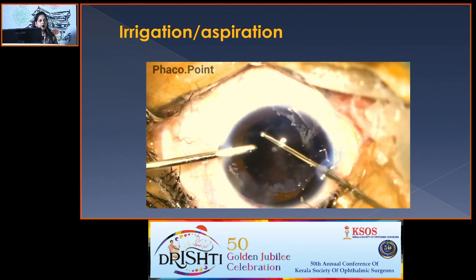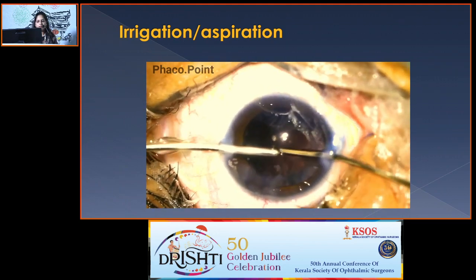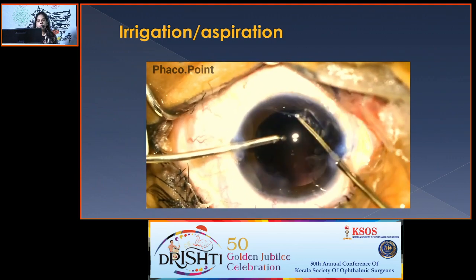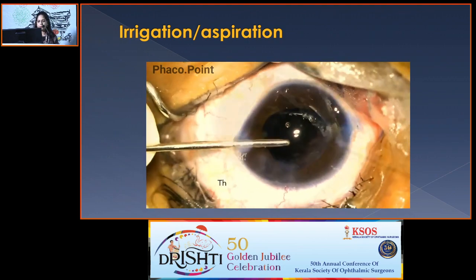Always hold the anterior lamina of the cortex and pull it tangentially towards the center to avoid stress on the zonules. Proceed in a clockwise or anti-clockwise manner, whichever is comfortable, because it is easy to remove the cortex from the adjacent area where it is already removed.